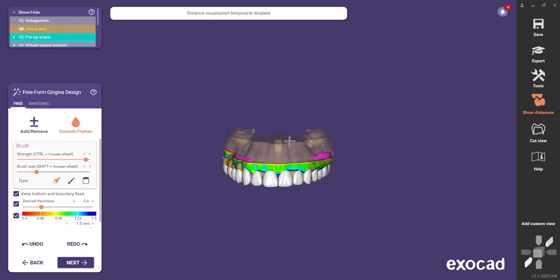We're always able to go with the smooth surface tool and just kind of run that across here just to make a nice smooth contour. I'll increase the strength so it's a bit more active. That is roughly what I would do here. I'm going to add a bit to the necks of these centrals, thicken that up, maybe on the canines as well. And then once again, I'm just going to smooth it ever so slightly. So there's our virtual wax up, kind of quick and dirty. I'm going to click Next.